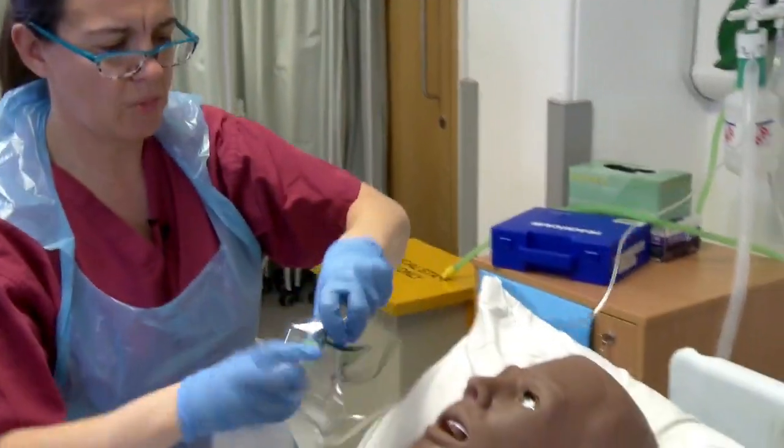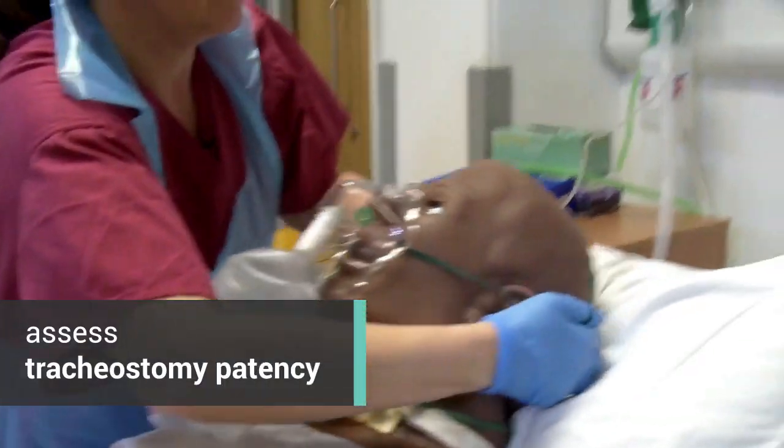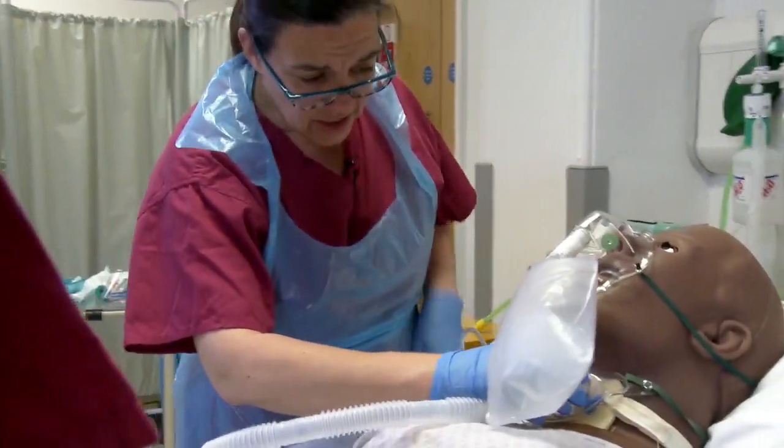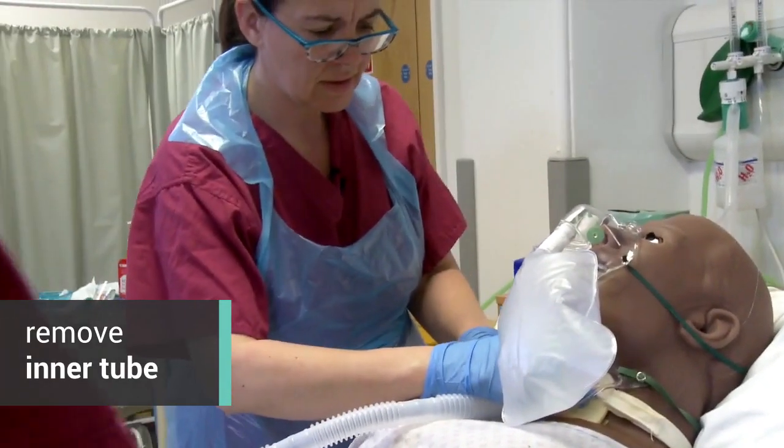And then the next stage, once that's on, is to assess the tracheostomy patency. He doesn't have a speaking valve or cap, does he? No. Can you take out the inner tube, please?